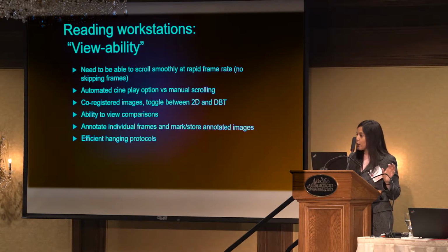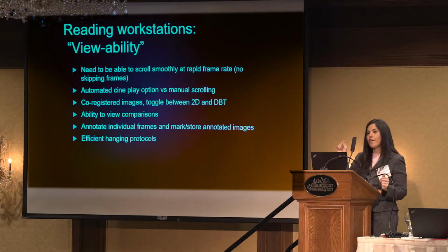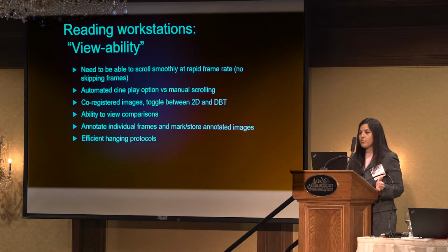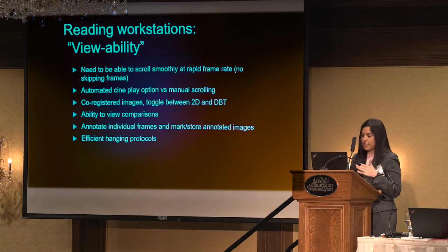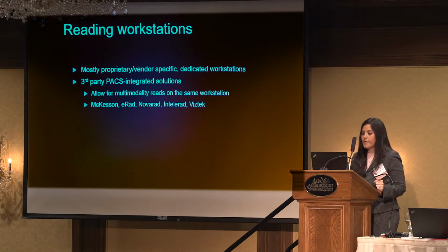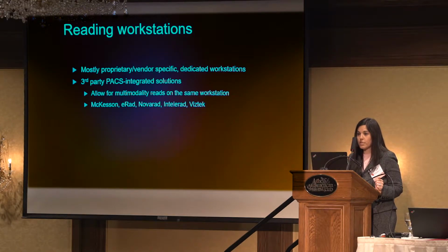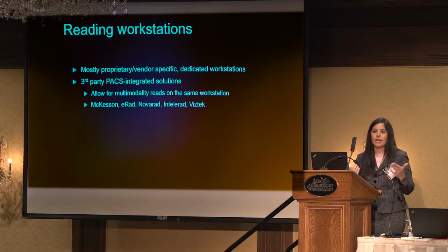It's great to have co-registered images where the synthesized mammogram and the 3D are co-registered, so if there's a finding you're questioning, you can problem solve by toggling back and forth between the 3D and the 2D or synthetic mammogram. You need to be able to view comparisons. You need to be able to annotate individual images and develop efficient hanging protocols. As I mentioned before, most vendors have proprietary dedicated mammography workstations. However, there are third-party PACS integrated solutions available, so look into that if you're interested, and potentially the PACS that you're already using has a mammo upgrade.